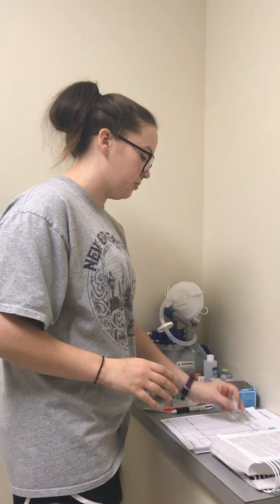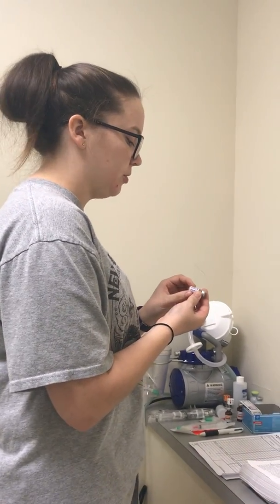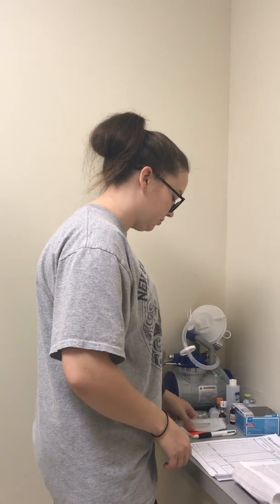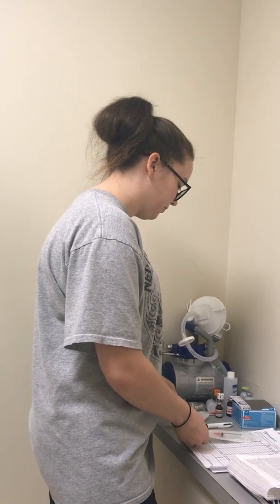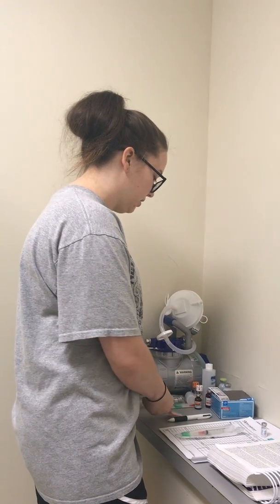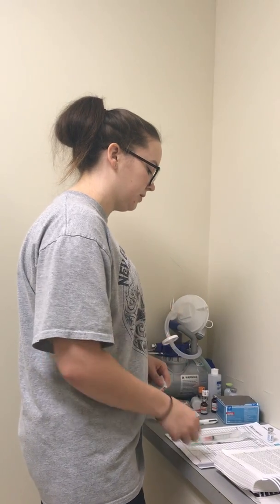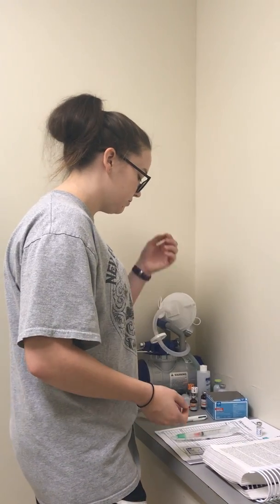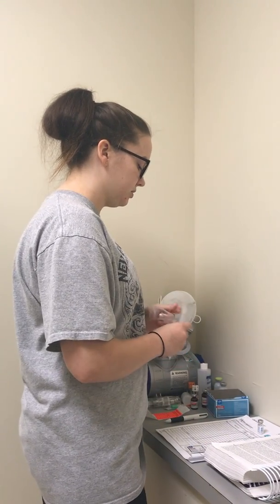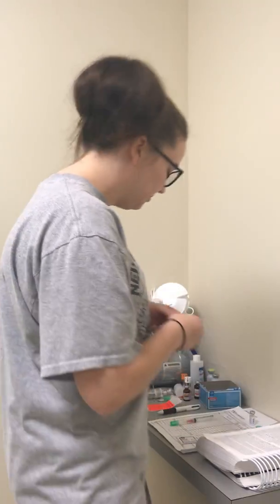Okay, checking with my morphine for the second time. Would make sure that I have the appropriate bottle for my 3 checks of medicine. That's only the second. I would get my syringe with the needle already applied. I would get my label and 2 swabs of antiseptic. And I guess I would go ahead, take out the syringe, and leave it.